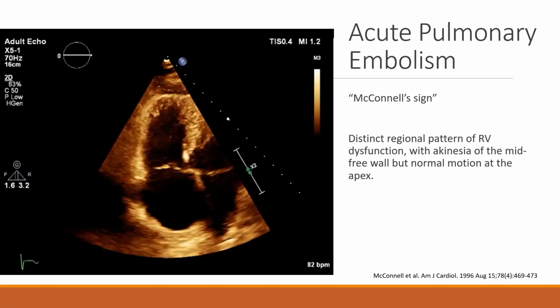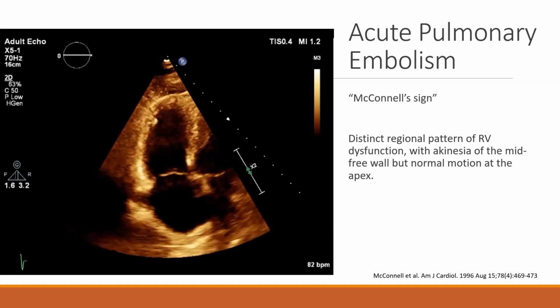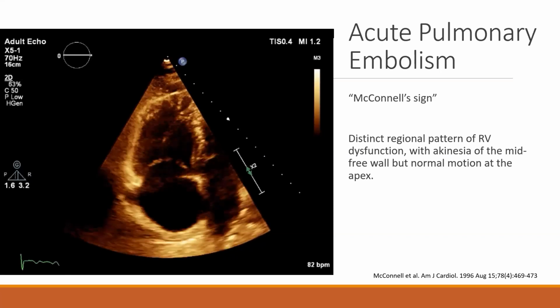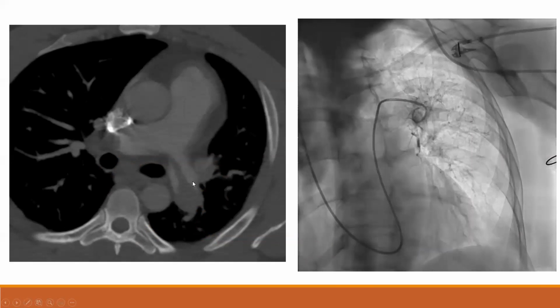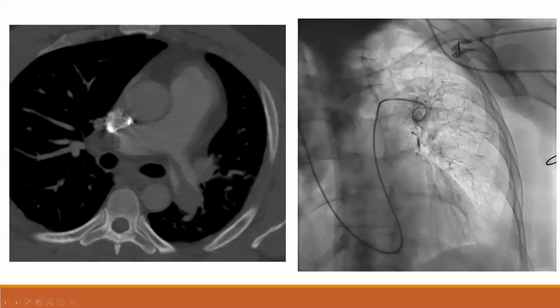These patients have, this is typically when people have a massive or submassive pulmonary embolus, you start to see right ventricular dysfunction. But this is a distinct pattern where there's near akinesis of the mid-free wall, but normal motion of the apex. And here's our patient's CT scanning. You can see that there's a saddle pulmonary embolus.